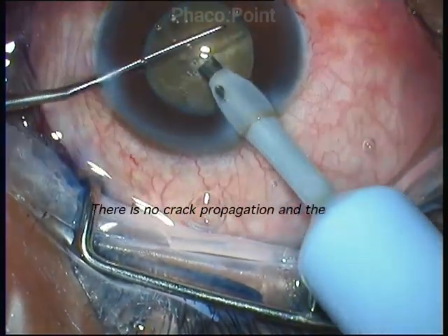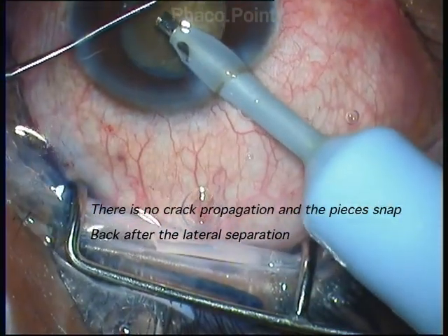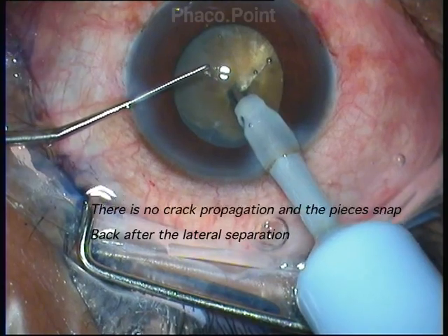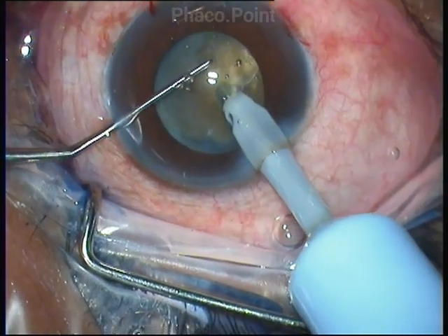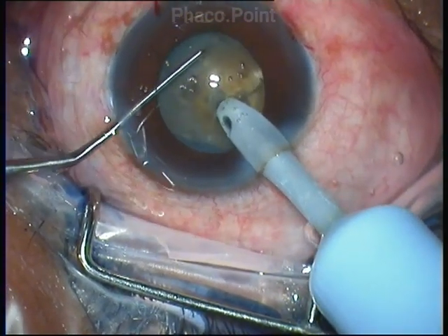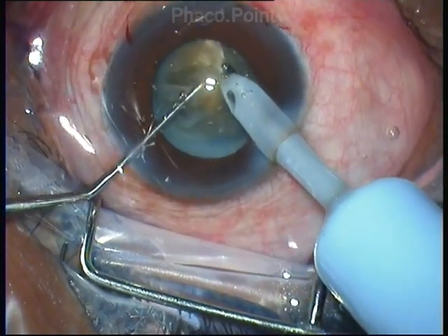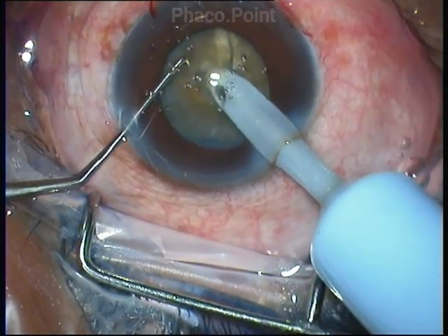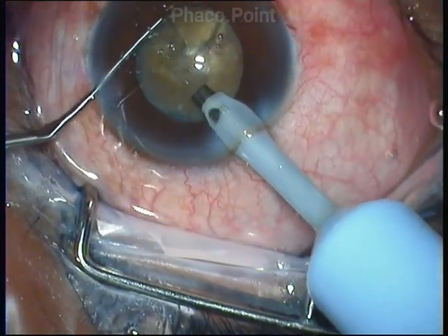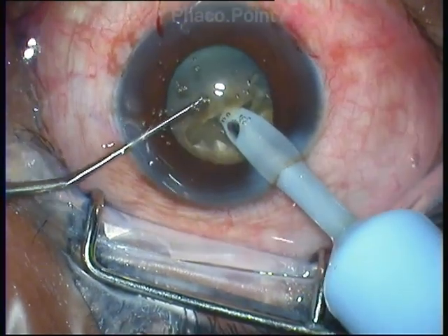You also find that this crack remains put in the region where I initiate the crack. There is no propagation of the crack, which is indicative of the loss of the crystalline nature of the nucleus. In fact, in this particular segment, you can find that as soon as I let go, the piece simply snaps back into position. This is quite indicative of the fact that there is no crack propagation. This is because the nucleus has lost its crystalline nature and has become amorphous.